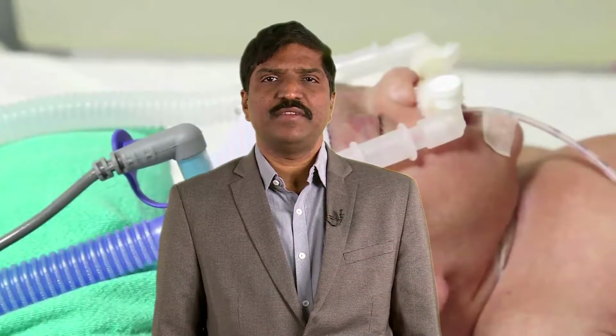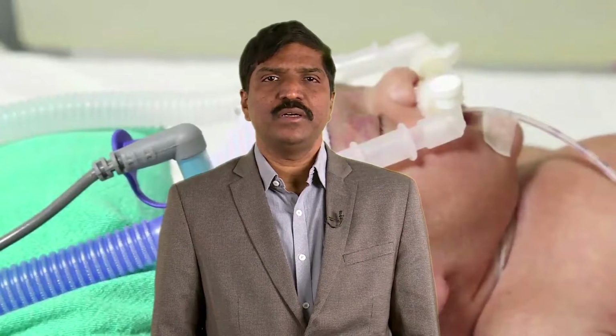Monitoring of the CPAP system includes recording of the CPAP pressure, FiO2 and flow rate. Bubble chamber should be monitored for bubbling and the water level. Humidifier set in the invasive mode, set temperature of 37 degrees Celsius on the humidifier, adequate water in the chamber, no condensation in the inspiratory limb and some condensation in the expiratory limb are proof of good and adequate humidification.